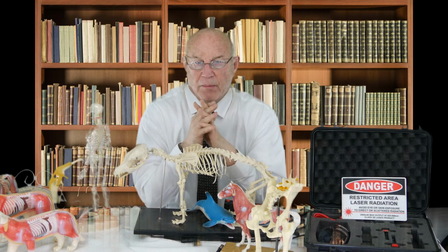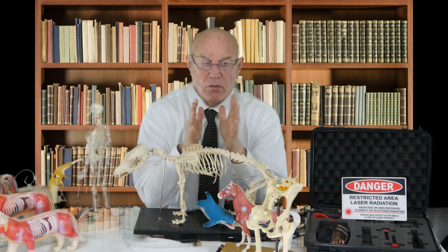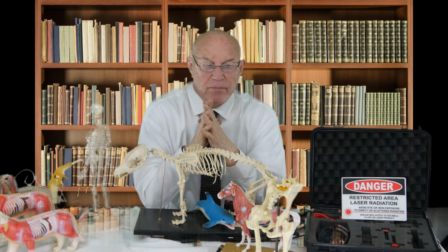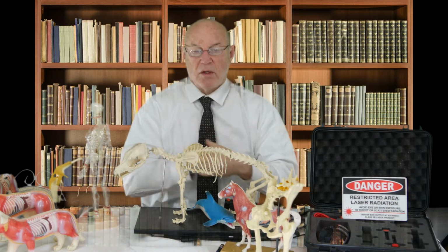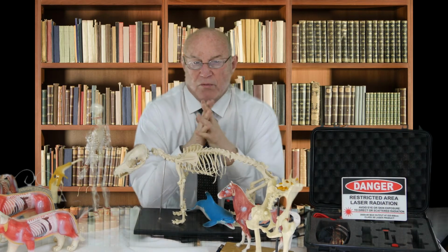What we did, about 10 years ago, was a bunch of research trying to figure out what frequency could stimulate those particular cells to create glial-derived neurotrophic factor. And we found, of course, that frequency. That frequency is what we use in most of our protocols for treating paralysis and paresis in the dog, the cat, the horse, and in the human, especially for peripheral neuropathy.